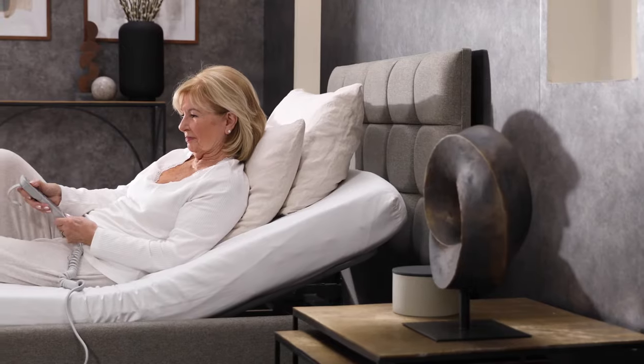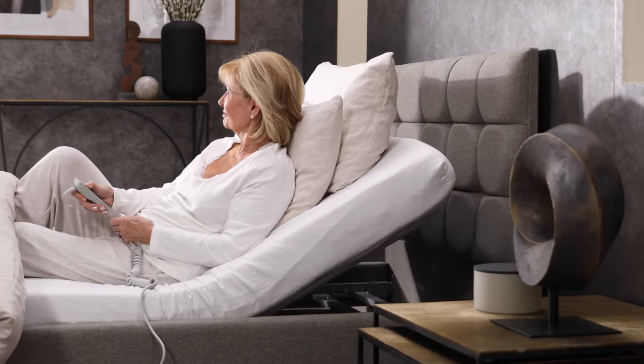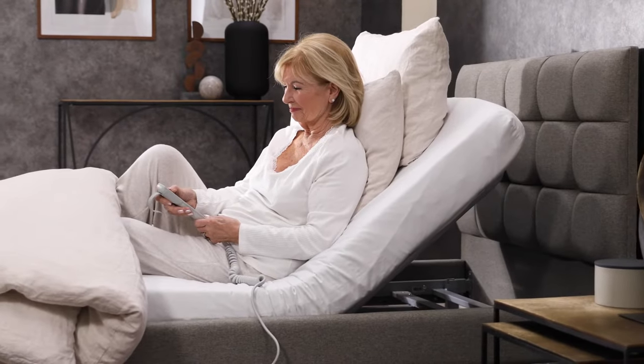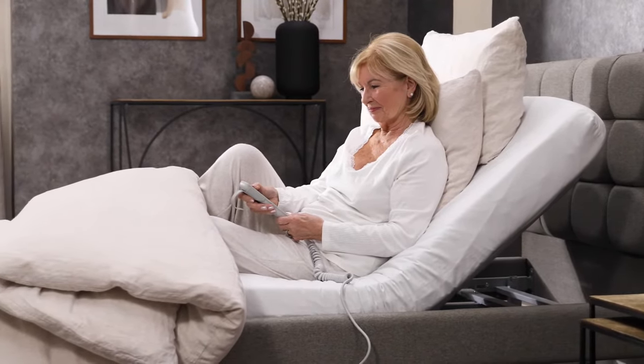The ability to elevate the backrest has a number of benefits. You can sit upright in bed to read and relax. Sleeping in a slightly elevated position can also help to ease breathing and minimize acid reflux.